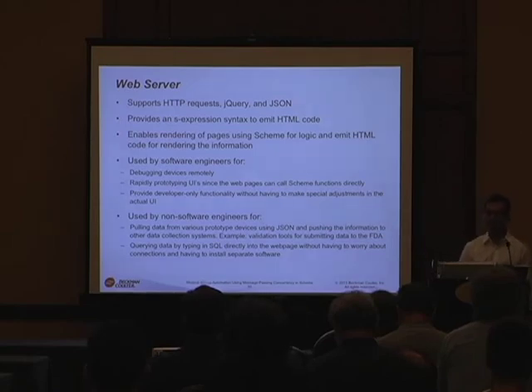Lastly, a lot of this boils down to, because we have these devices, and this is in the development phase especially, there's a lot of debugging going on at a system level, figuring out what goes wrong, what's happening. So we implemented a web server and an S-expression-based sort of DSL just for programmers to write it, so that we can not only emit HTML code, but use the power of Scheme in it. And this way we can actually debug instruments remotely.